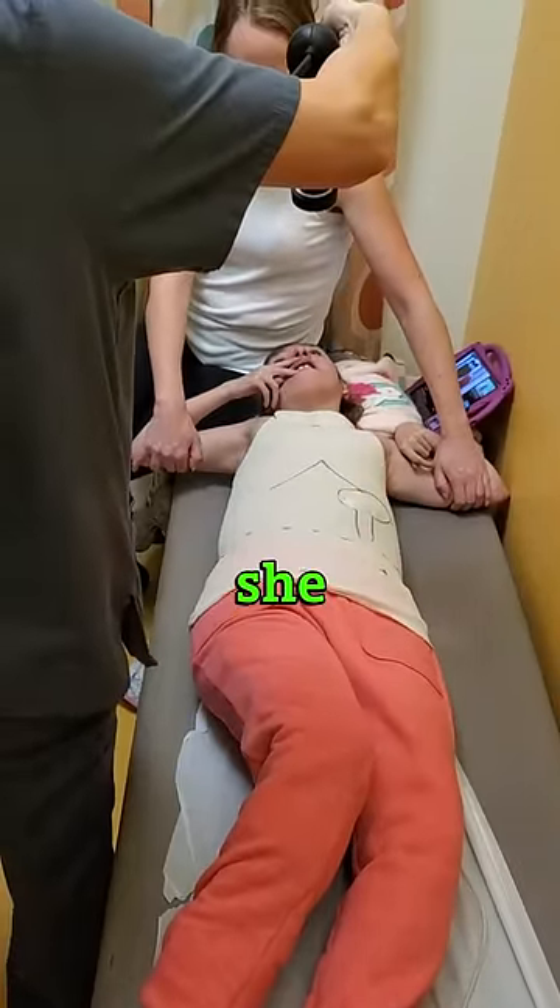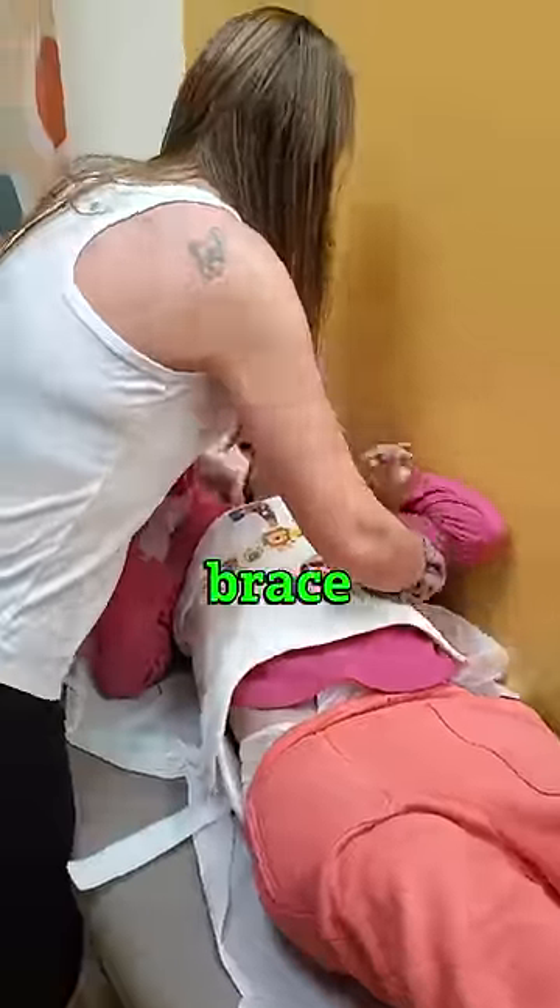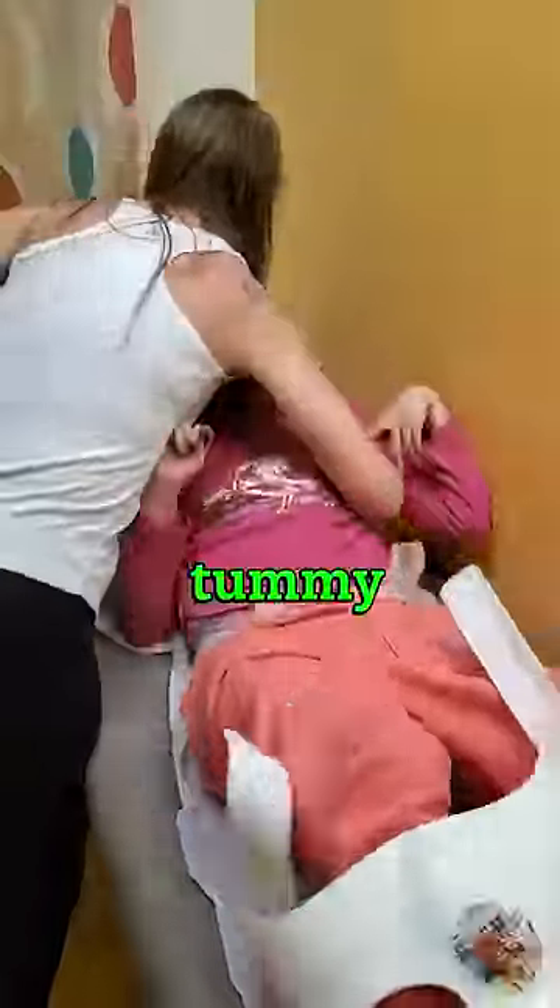People always ask me how she gets a tummy brace made. I have to take off her old tummy brace. I lay her flat so the doctor can see how big her tummy is.